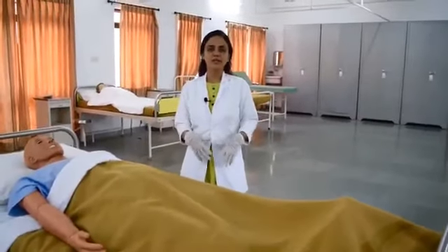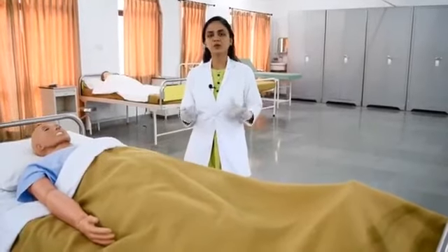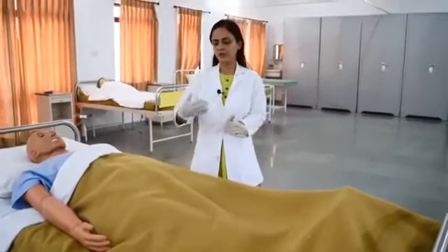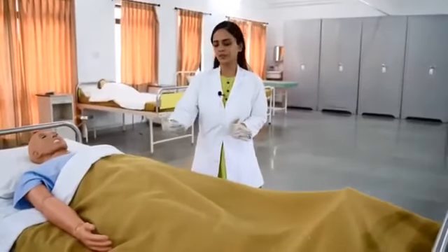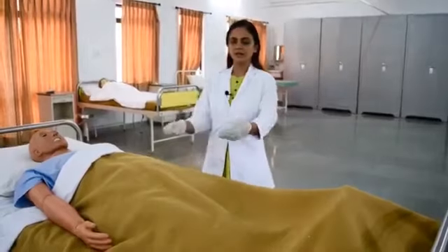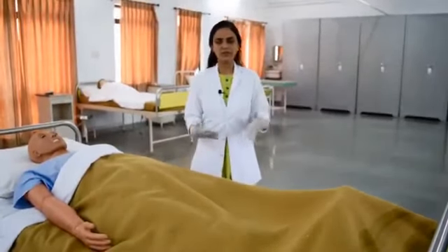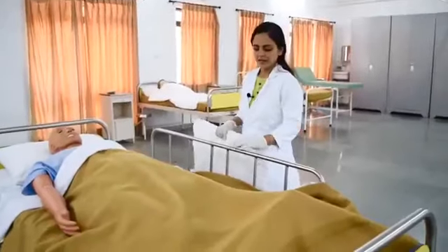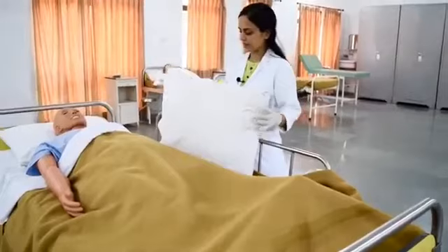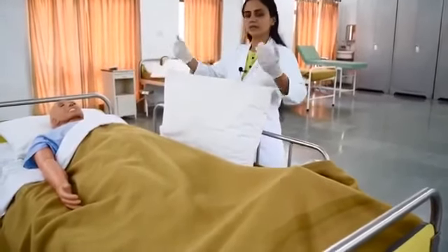If nobody is available for assistance on this side to hold the patient, then what do we have to do? We have to keep the railings up and place a pillow here between the patient and the railings, right? So that the patient has support and will not fall down. We keep this railing up, place this pillow here, and then from that side we will turn the patient.